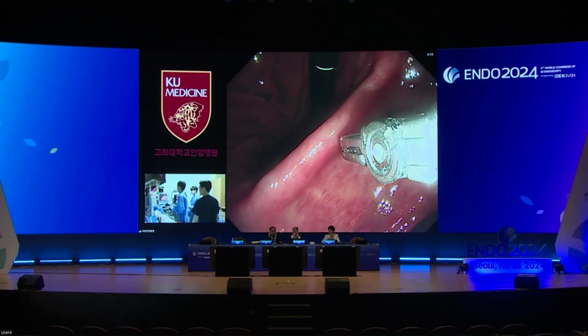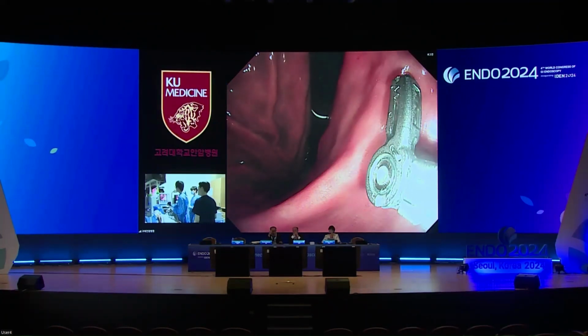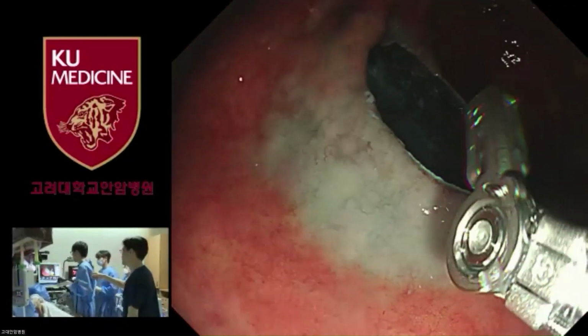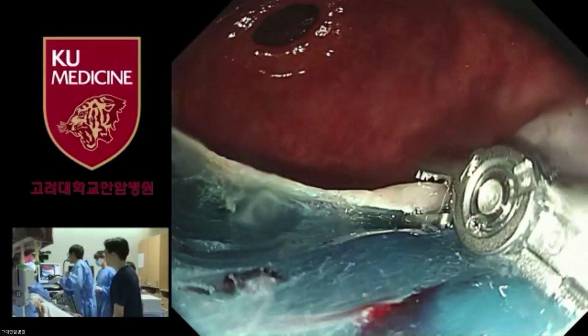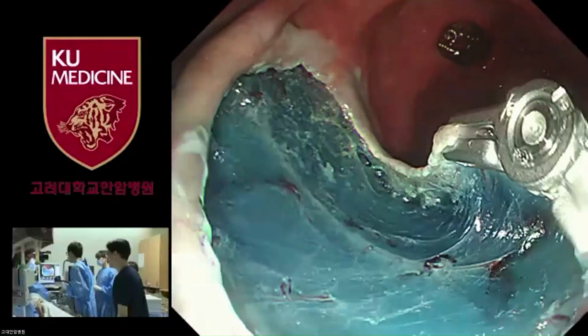Can you suture the ulcer with this robot, especially in the colon? Can you close the ESD defect with the clip and the robot? Yes, and we can show you. If we want to close this defect, you can just grab one side, the end of the mucosa, and pull. Pull the mucosa to the other side and approximate them.